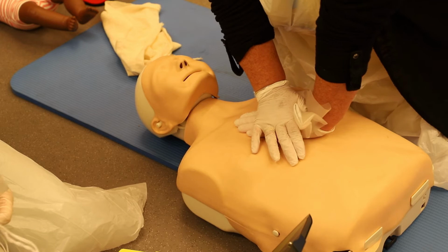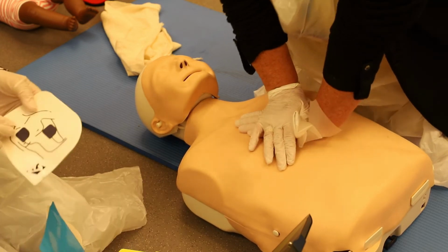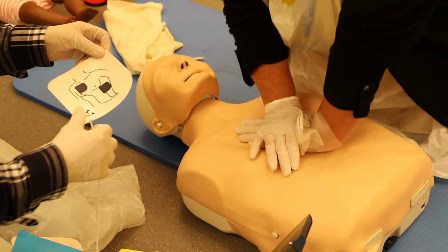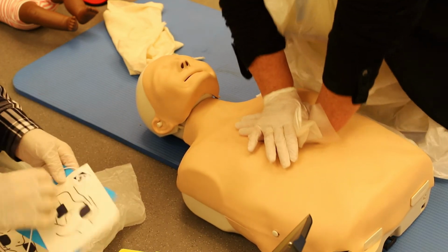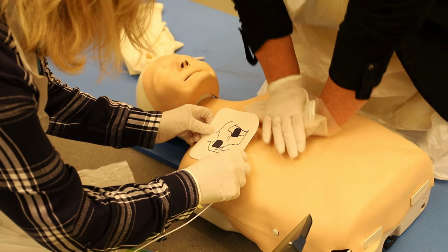So imagine I've given my casualty 2 breaths, and then I will continue with my 30 compressions. Peel 1 pad from plastic liner. I will continue to do this while my colleague applies the pads to the casualty. Upper chest.